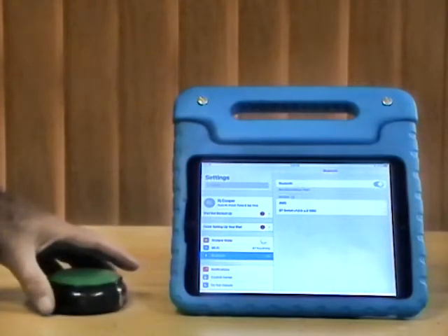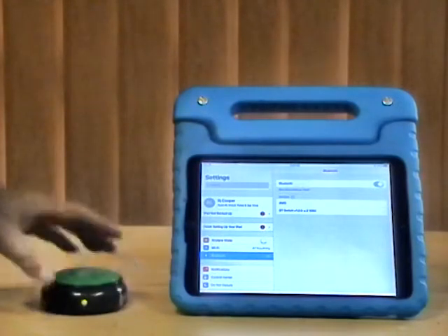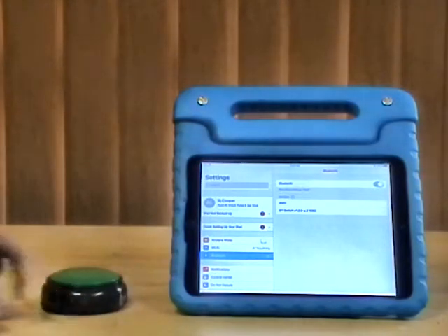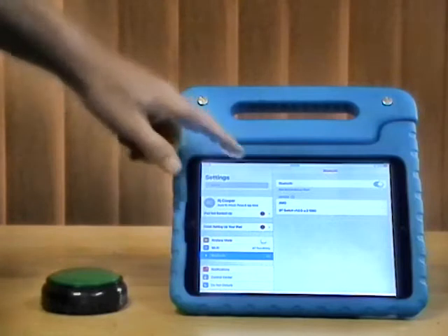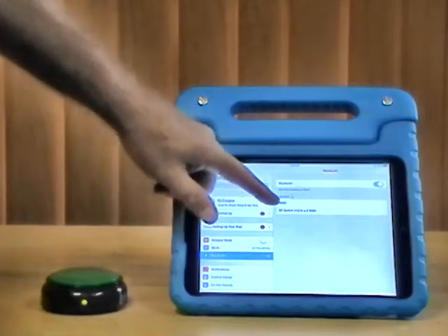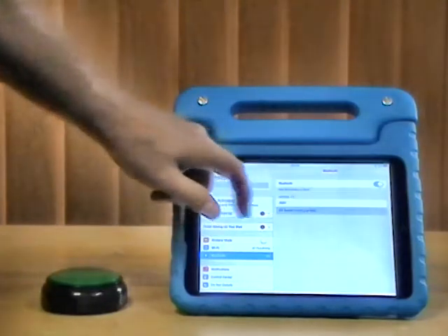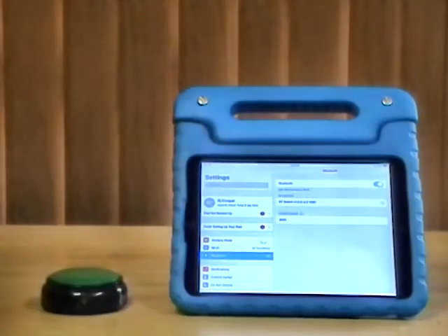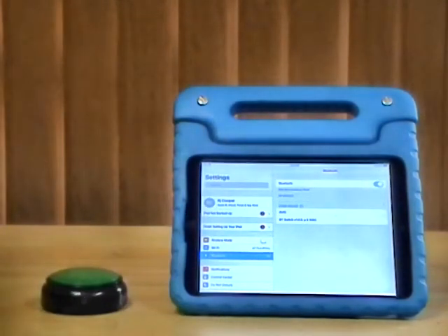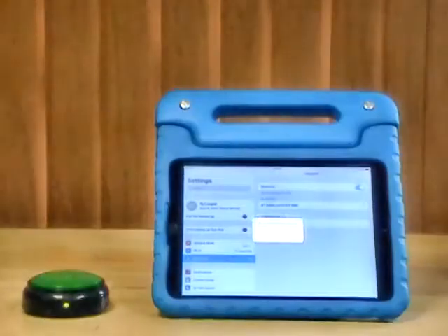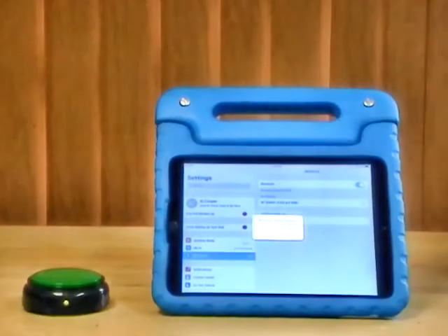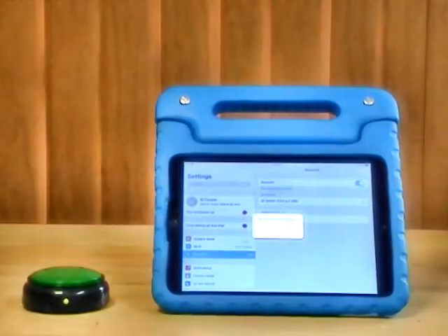The light will start blinking green pretty quickly and it should show up right away on the iPad. I simply tap it. It'll ask me if I'm sure that I want to pair it and I tap pair.